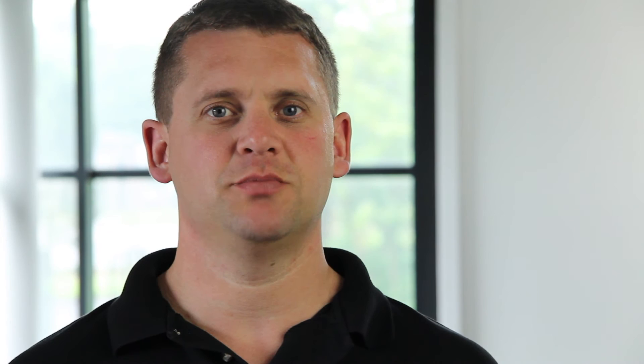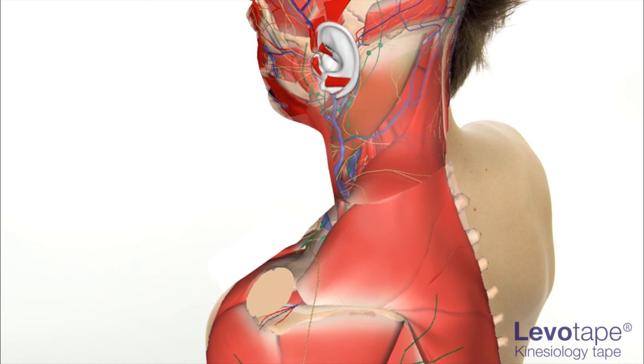Kinesiology taping has revolutionised clinical practice in recent years. Developed some 30 years ago as kinesiotape, this taping method should be viewed more as a therapy than a taping technique. VivoMed has been at the forefront of the developments of the use of kinesiology tape in the UK and Ireland.